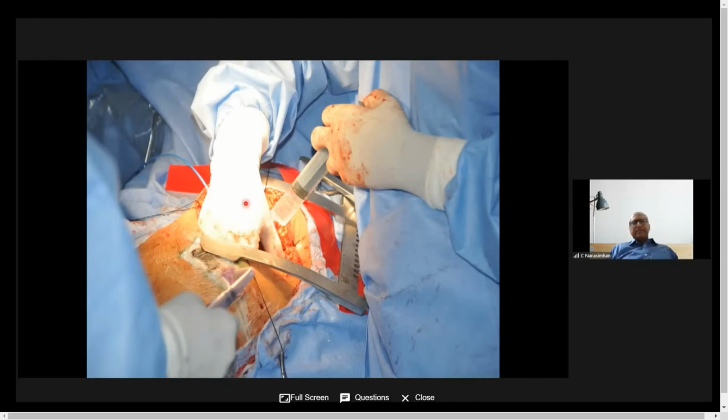This is a surgeon holding the ablation catheter, which is taped to his finger, and you are irrigating from it so that it doesn't get heated up. Simultaneously, we are irrigating the tip of the surgeon's finger. You can ask the surgeon to map with this and successfully ablate the VT.